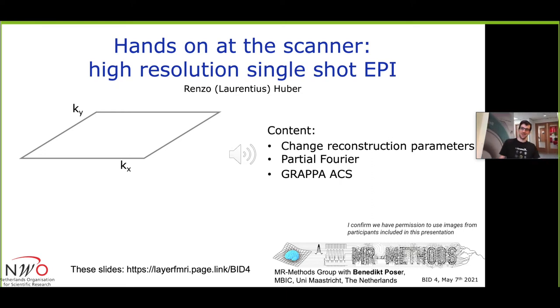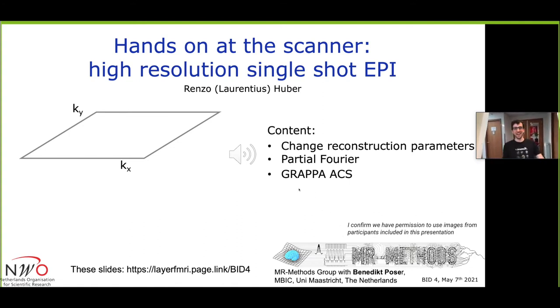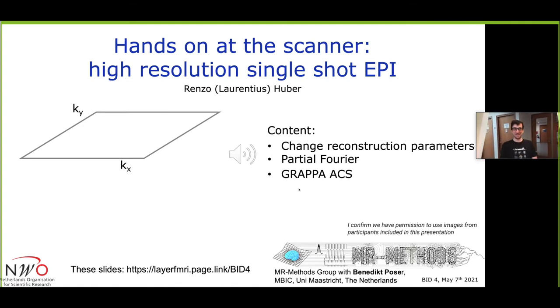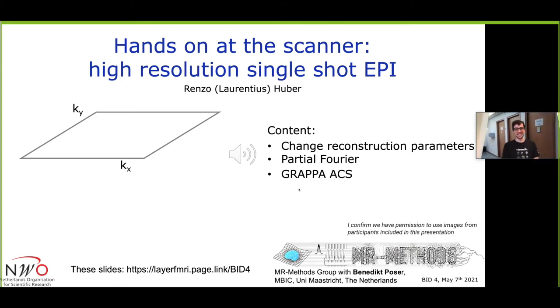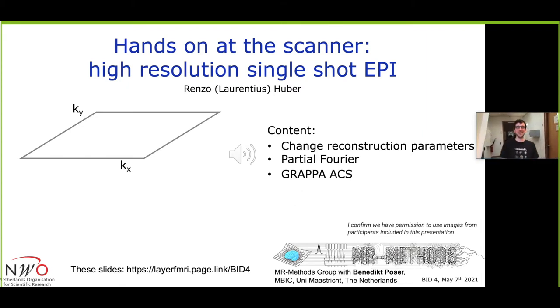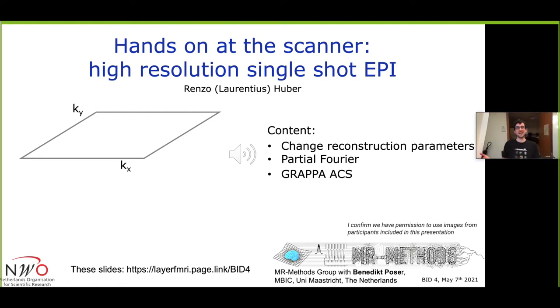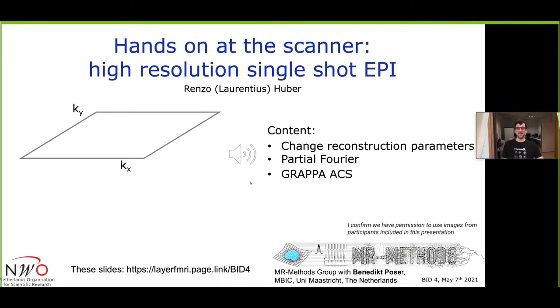So now we are going to the scanner and this is our lovely setup in Maastricht at Scannexus. I would like to show you the things that I'm usually doing when I do layer dependent fMRI as opposed to those things that I'm doing when I'm not doing layer dependent fMRI.